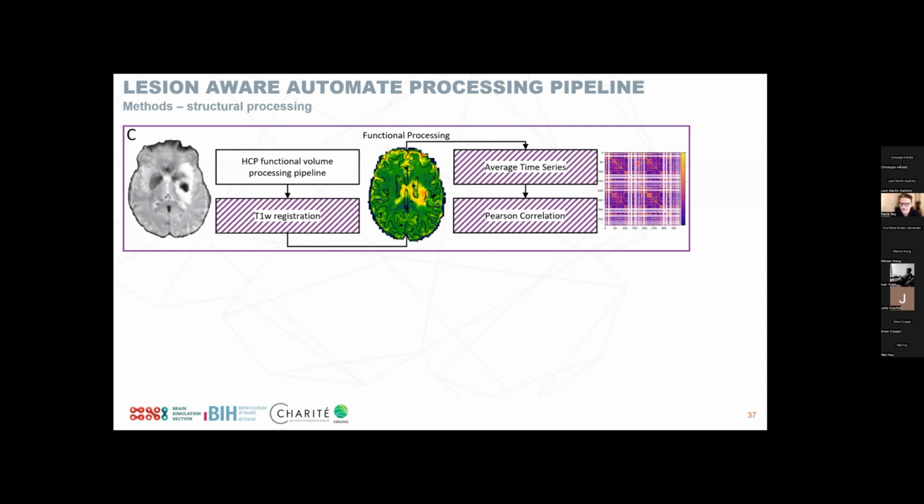So we end up with these large parts of the functional connectivity matrix that are actually empty, because we do not have these regions, which again poses a little bit of an issue if we want to do some inference and analysis regarding stroke biomarkers on this data. We already started with the problem of the raw data not providing everything, and then it just keeps being carried through all the way to the downstream analysis and processing steps.